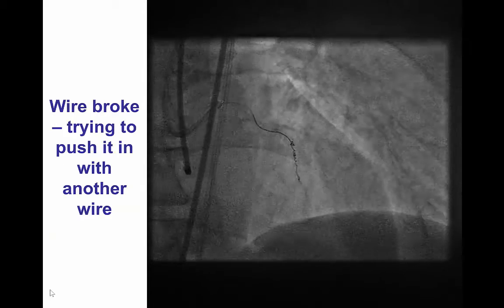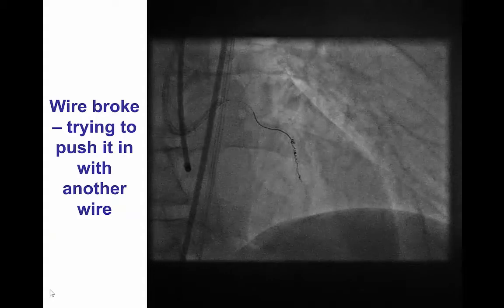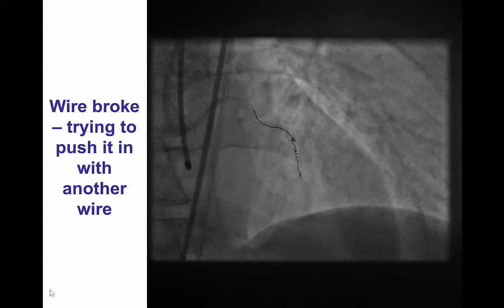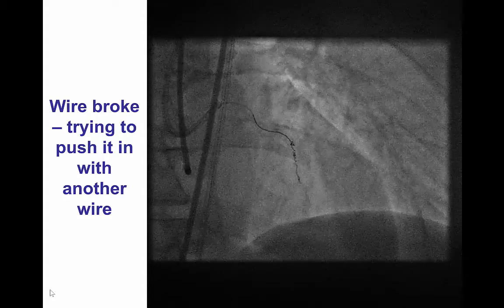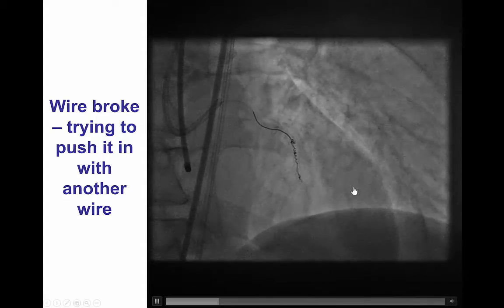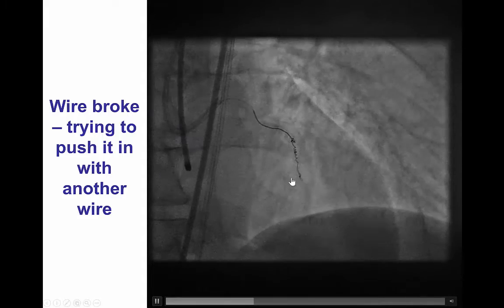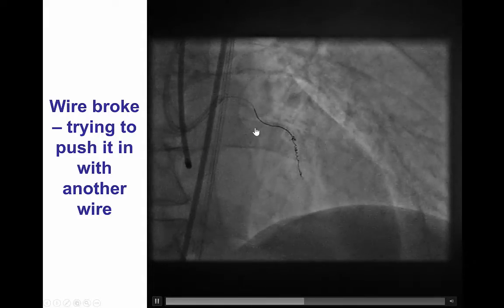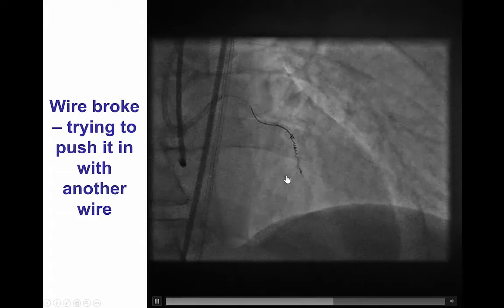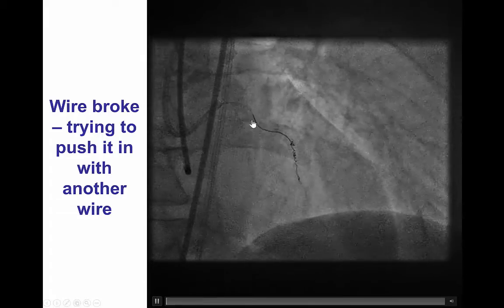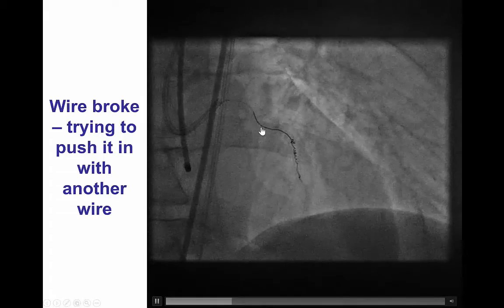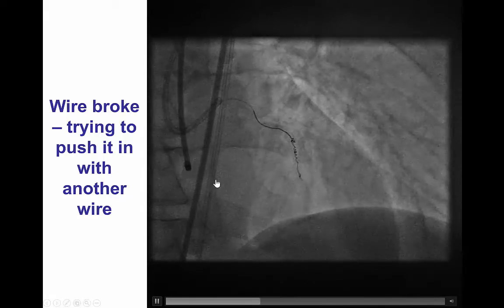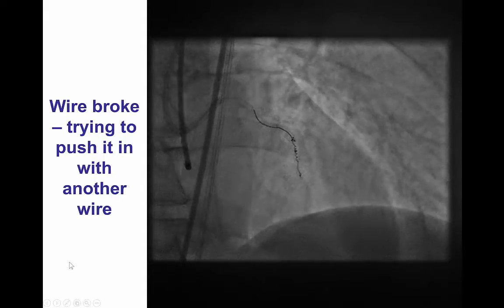Moreover, during attempts of back and forth, the wire broke. So we have a situation here where we have a broken part of a Fielder LXT guidewire in the mid LAD with the Finecross microcatheter coming to the proximal portion.